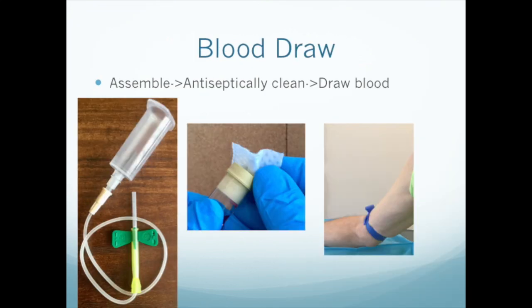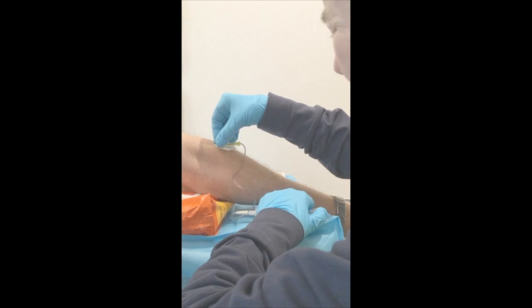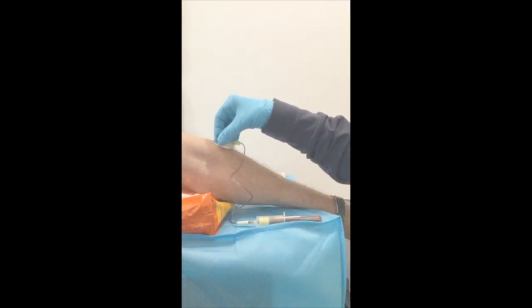Now for the blood draw. First, assemble the butterfly needle and vacutainer hub by screwing them together. Then antiseptically clean both the patient's skin and the cap of the ACDA tubes. In a normal blood draw, we wouldn't worry much about this since it would be going to the lab, but this blood is eventually going back into the patient, so we need to be extra cautious to avoid contamination. Apply the tourniquet, proceed with the venipuncture, and draw as many tubes as needed. You can expect about 1 milliliter of PRP for each tube.